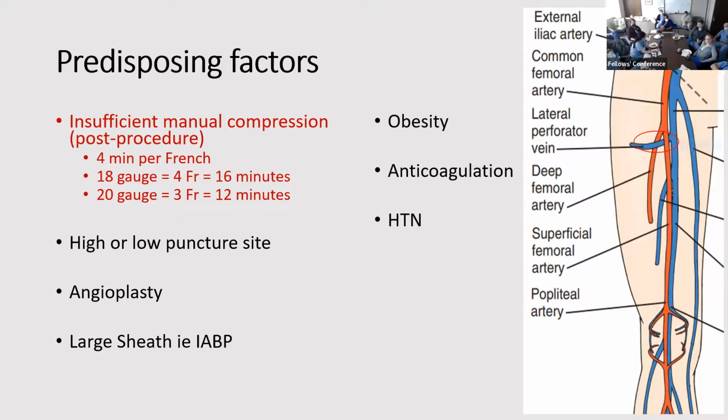What do you call that? A FemoStop. Is there a pressure that you use? So I usually do 80 to 100. On the directions for the FemoStop, they'll tell you what to do. I tend to go up a little bit higher for those who are more hypertensive.